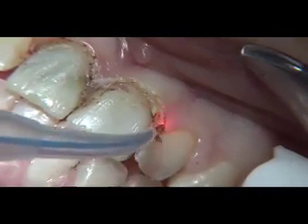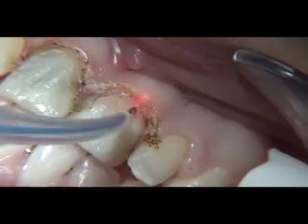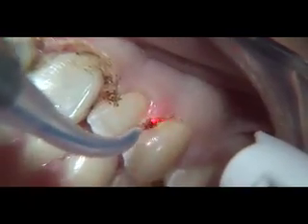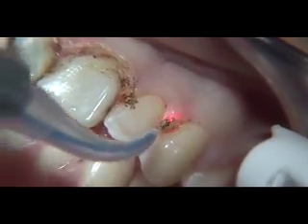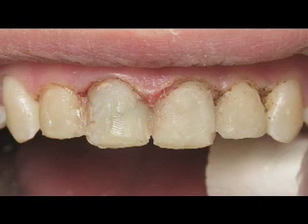As we come to the completion of our gingivoplasty and crown lengthening, we will want to verify our results. We do so by adding a quick veneer layer of composite to double-check the proper golden proportion, or tooth height to width ratio. This valuable step gives us a thumbnail view of what we can expect in our final results, and it only takes one or two minutes to add the composite.